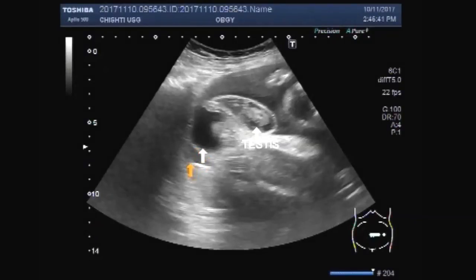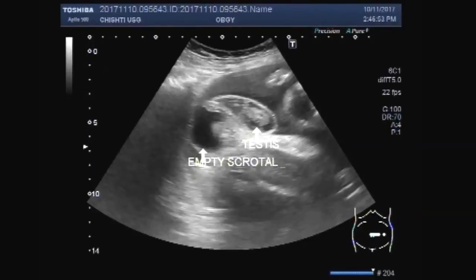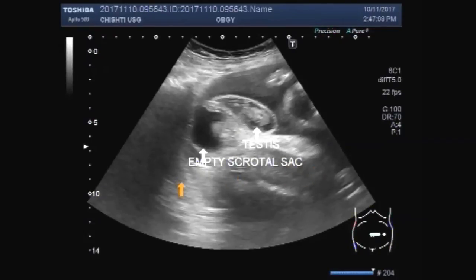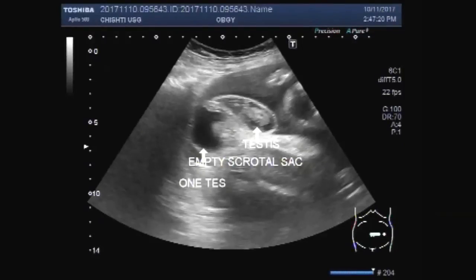These are both testes. This scrotal sac is empty. That is the undescended testis — one testis is undescended.